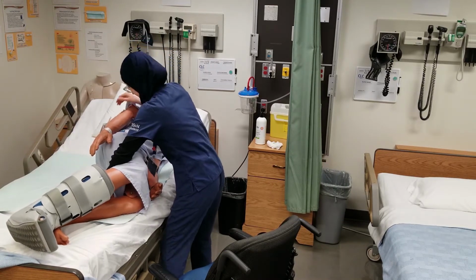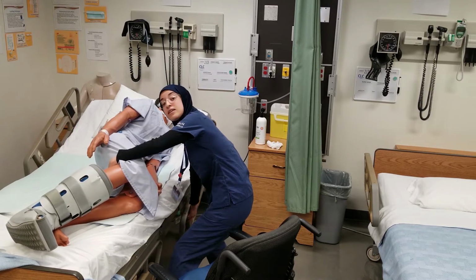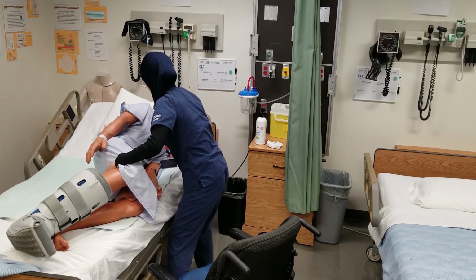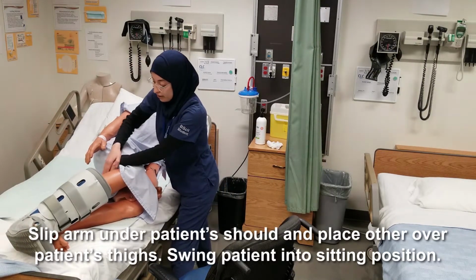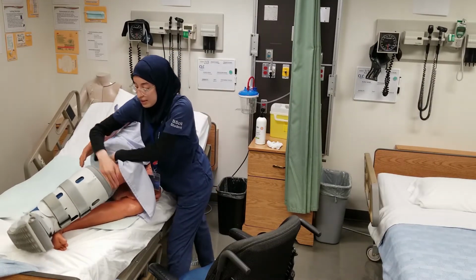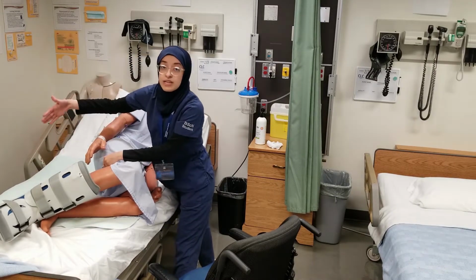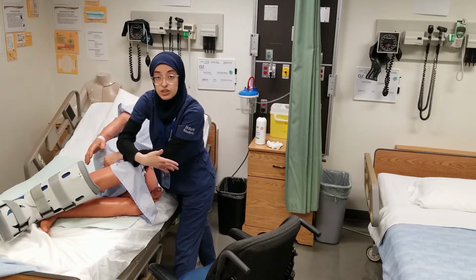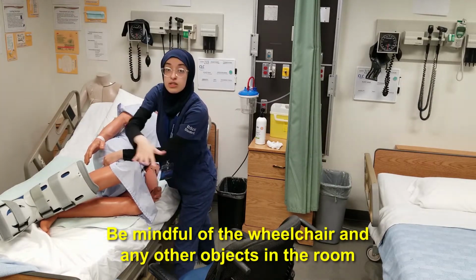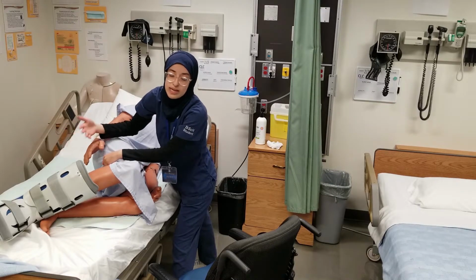Great. At this point, I'm going to lower the bed just slightly because I'm going to be bending my knees as I'm swinging the patient up. So I want to make sure that my arm is underneath the shoulder and my other arm is over the thighs. And I want to bend the legs slightly because my wheelchair is at the foot of the bed. As I'm swinging, there's potential that the patient's legs are going to swing into the wheelchair. Now, we want to take that into consideration when we're placing the wheelchair so that that doesn't happen, but sometimes there is no way to prevent that.